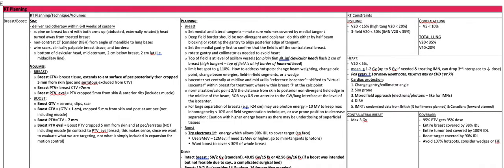For planning the breast, you set the medial and lateral tangents. Make sure the volumes are covered by the medial tangent. The deep field border should be non-divergent and coplanar. Do this by either half-beam blocking or rotating the gantry to align the posterior edge of the tangent. Set the medial gantry first to confirm that the field is off of the contralateral breast. You then rotate the gantry and collimator as needed to avoid the heart. The top of the field is at the level of the axillary vessels on plain film at the inferior border of the clavicular head. Flash two centimeters of the breast anteriorly.